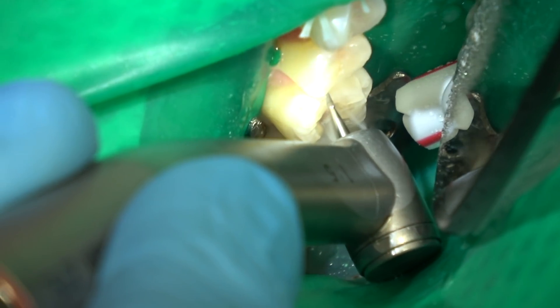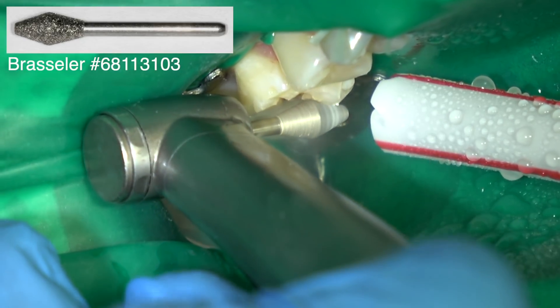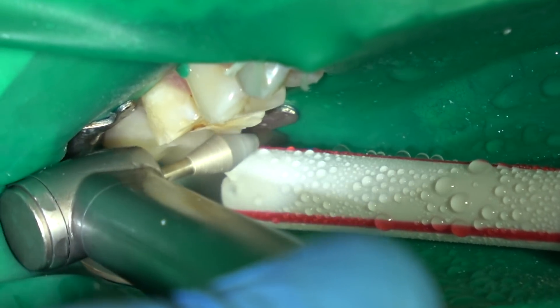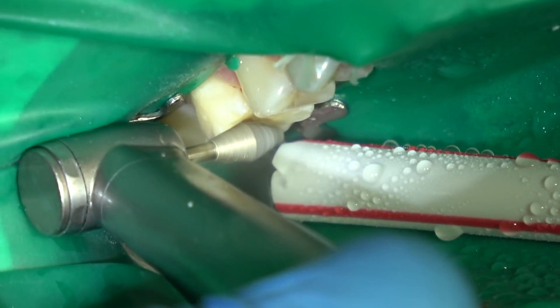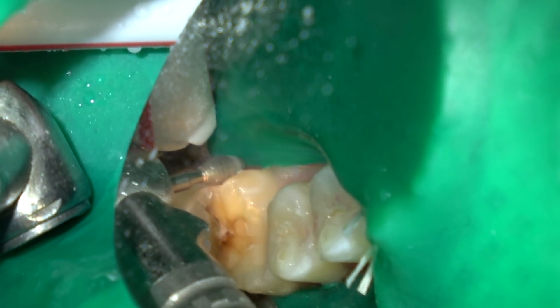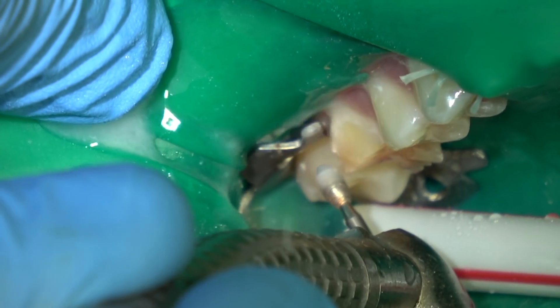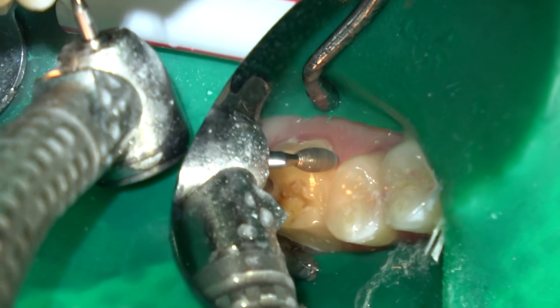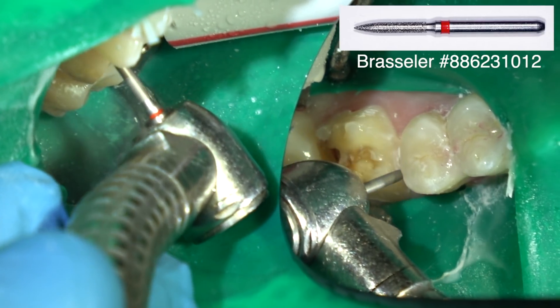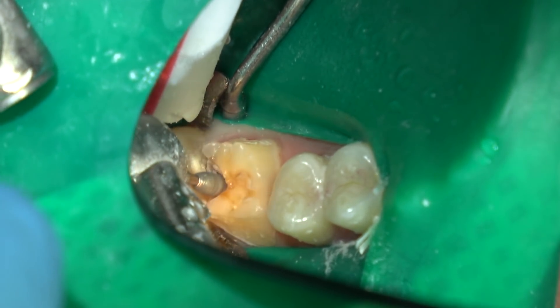First, preparing the tooth for a crown. If I'm performing endo and a crown, I normally prep the tooth for a crown first to get that behind us, then perform the endo. I use this occlusal reduction burr for a molar — very effective. Then a coarse football diamond for the initial facial/palatal prep because it's coarse and cuts quickly. I'm removing the bulk of the tooth and then will come back interproximally with the flame-shaped fine diamond.